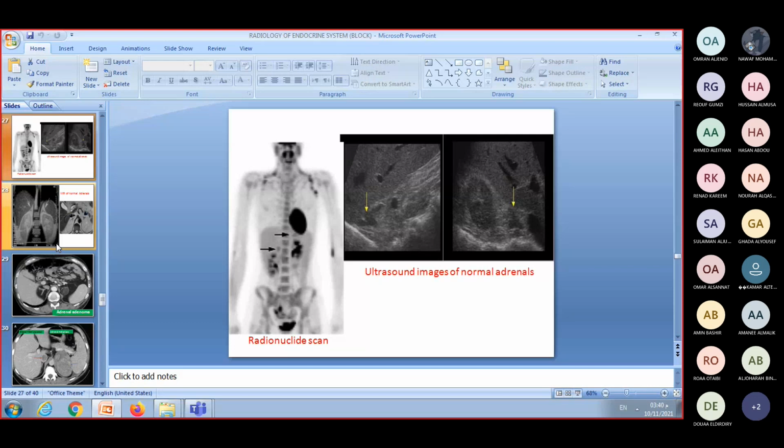the retrosternal enlargement of the thyroid lies behind the sternum, so there is a difficulty of assessment of any structure. Bone and air both cause obstacles in the assessment of the tissue. That is why, for example, we usually do not use transcranial ultrasound for brain tumors. Ultrasound has two limitations: the presence of air and bone.